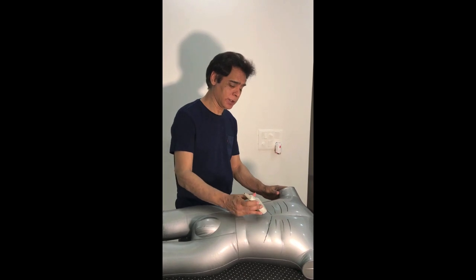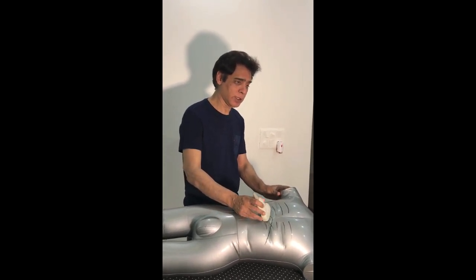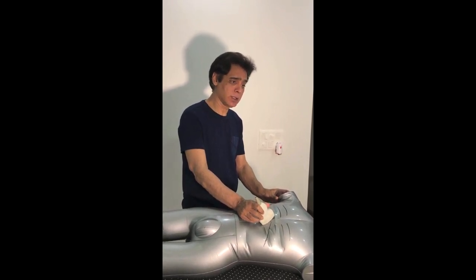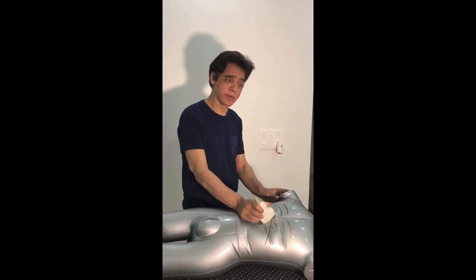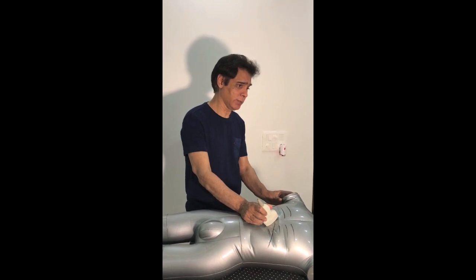The probe is kept transversely like this, and then we rotate the probe like this, and we get a section of the gallbladder neck with the portal vein and the CBD above it. Now, you can have a look at the section.